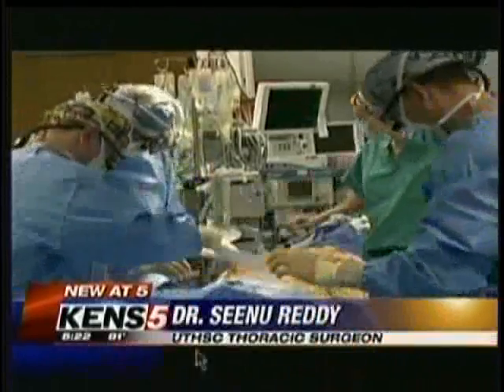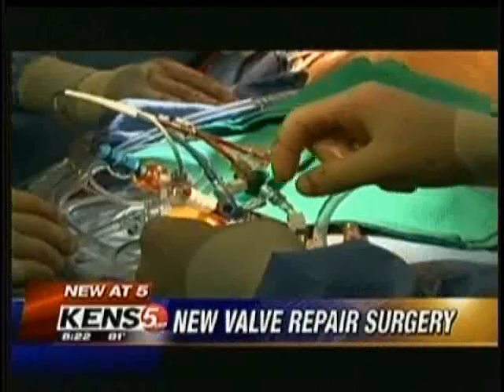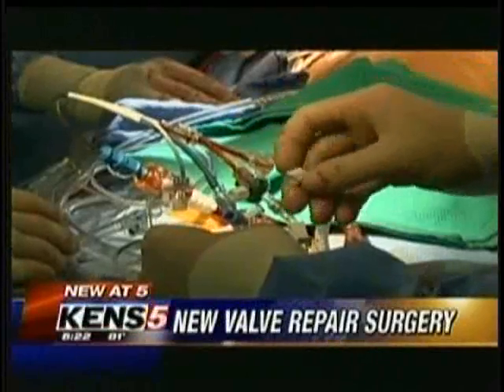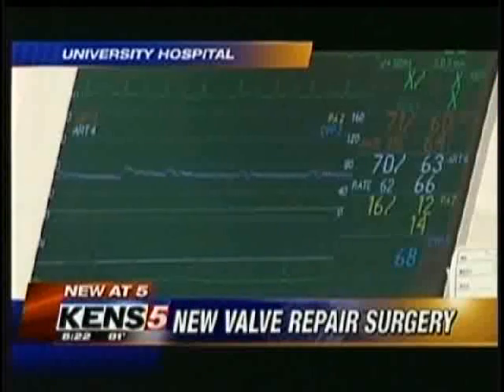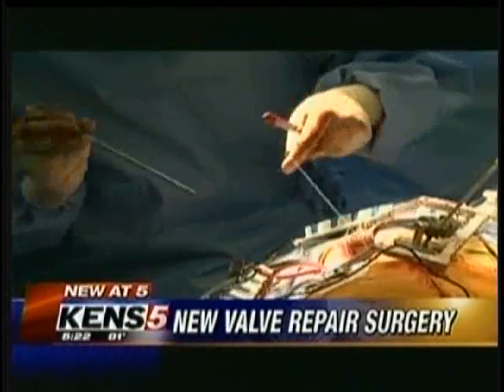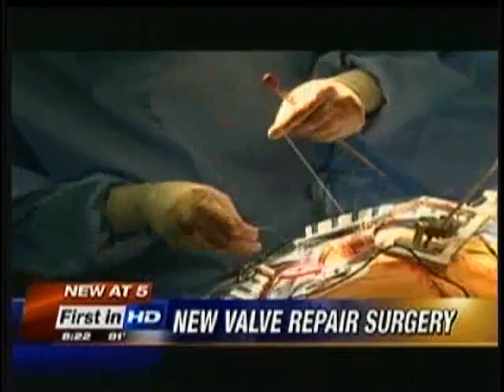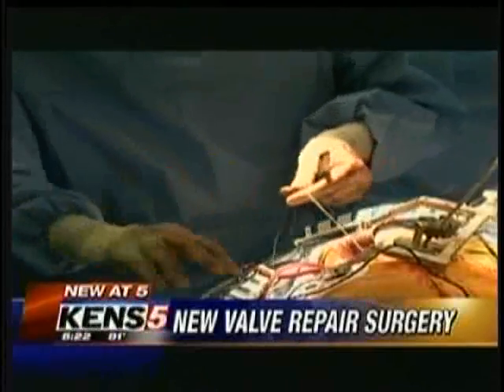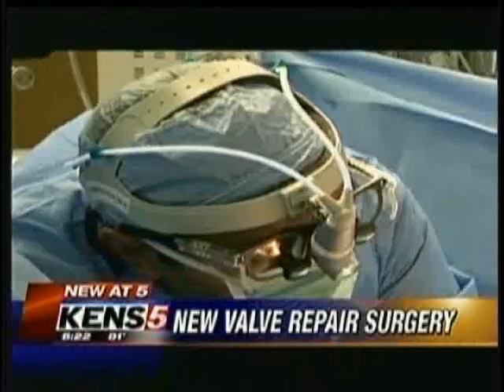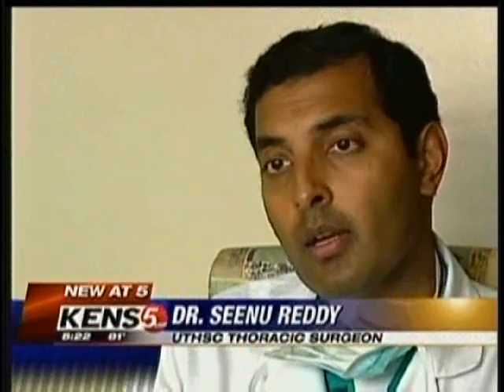Thoracic surgeon Dr. Seenu Reddy used a new approach on Kerr. In an operating room at University Hospital, he and a team of other specialists used catheters inserted through the neck and groin to deliver medicine that drains and stops the heart. Then, through a small incision in the right chest, Dr. Reddy used special lengthened tools, some more than a foot long, to reach deep into Kerr's chest and repair his mitral valve. "The doctor has a direct view of where he's working. The incision is smaller, it doesn't involve the dividing of any bone, and the overall trauma to the patient from the surgery is much less."